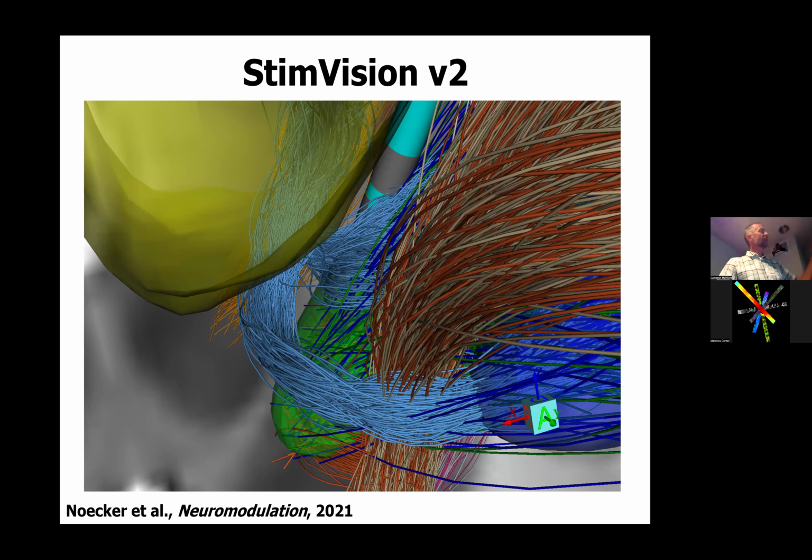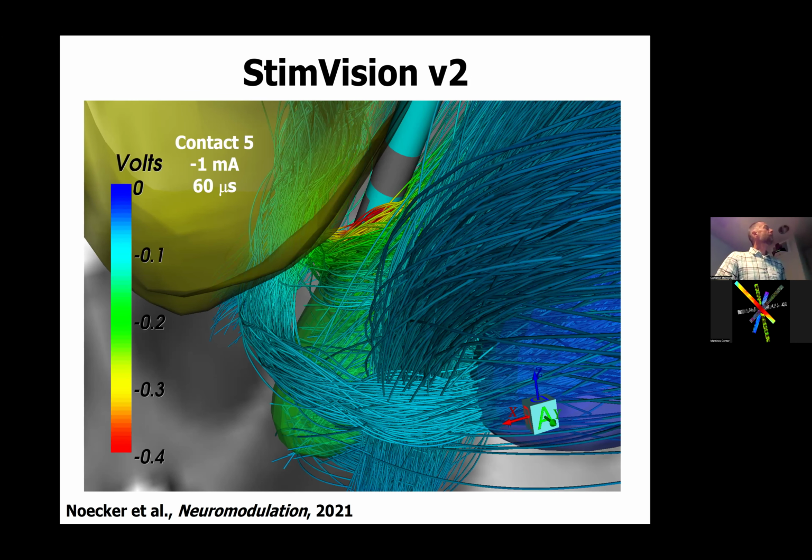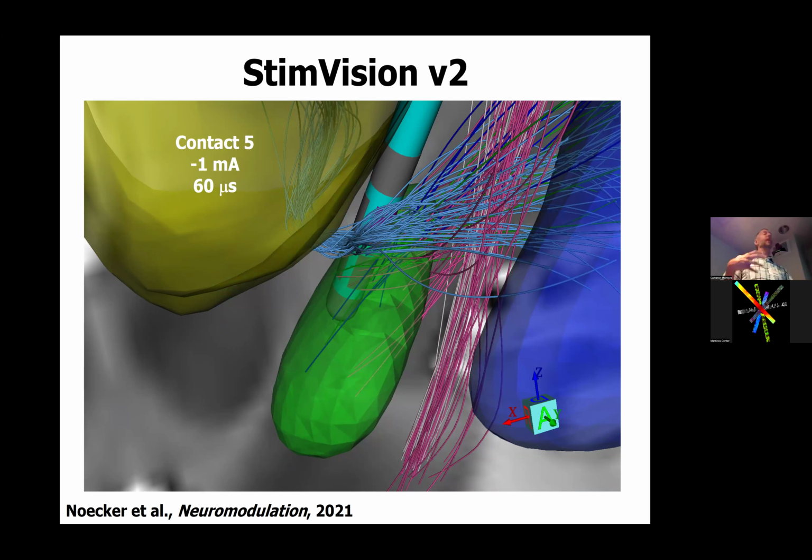Once again, you start with this anatomical fiber distribution, you apply your stimulation to that collection of axonal pathways, and then you pull out the streamlines or the pathways or the axon models that are directly stimulated by this very specific stimulation parameter setting, of which you have almost infinite different settings that you could simulate and test in a given patient.